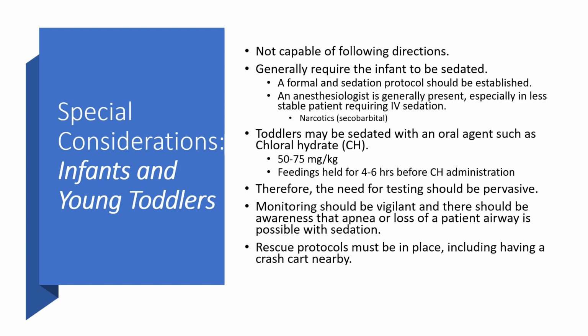Monitoring should be vigilant during the procedure, and those that are monitoring, the patient care team, need to be really astute and watching out for effects like apnea or loss of a patent airway, which are possible with various forms of sedation. Rescue protocols must be in place, including having a crash cart nearby.